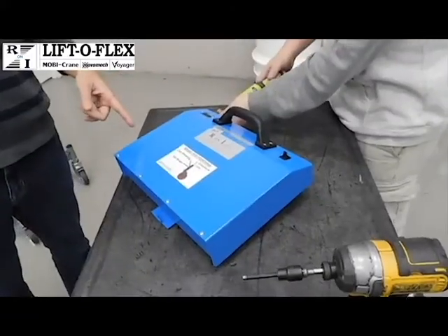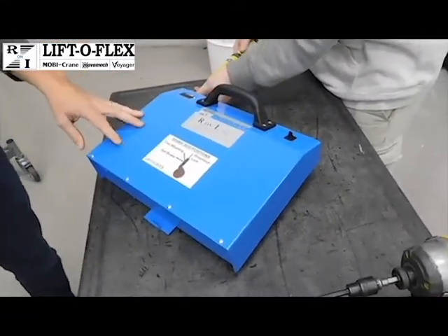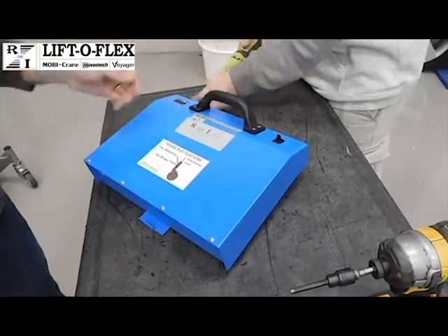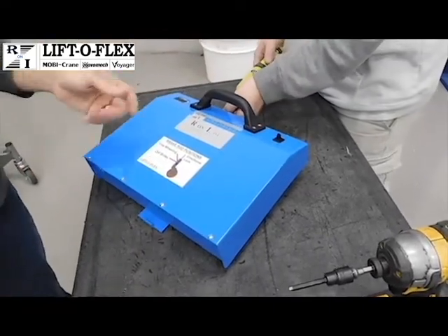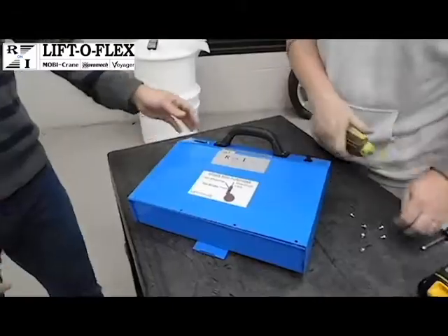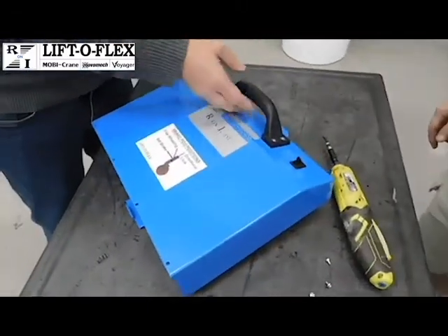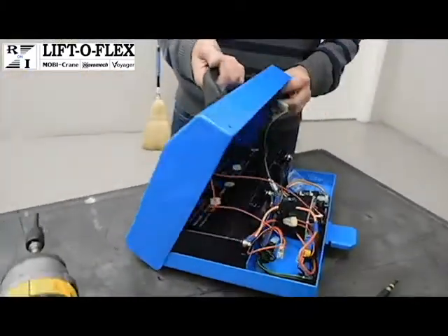So to access the controls that are inside the power pack, there's 8 Phillips head screws, 4 on the bottom, 4 on the top that need to be removed. That'll allow you access inside. One note, when opening the cover, just remember there are connected wires to the switch and the battery gauge, so you do just want to fold it down.